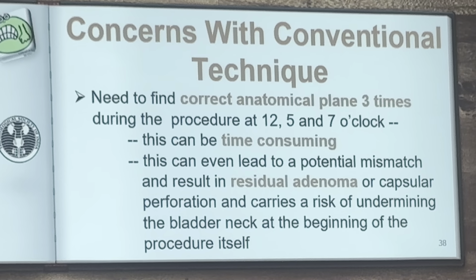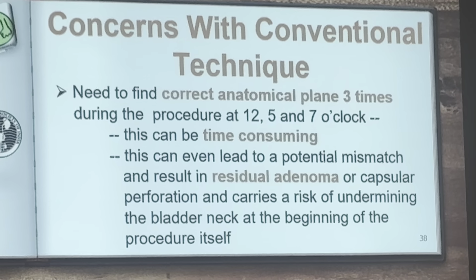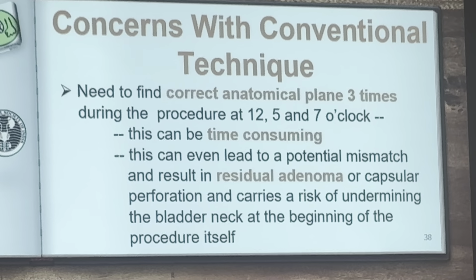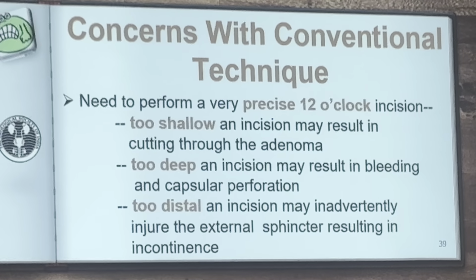And secondly, there can be a mismatch. You are coming from above downwards, and both the planes should match exactly. Otherwise, you can go superficial at one level and deep at another level. Then there will be a size mismatch. So this is the problem with this technique.